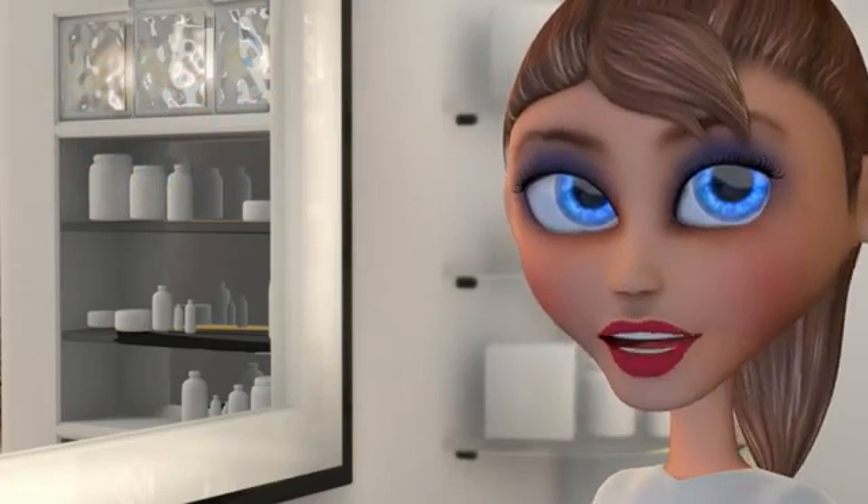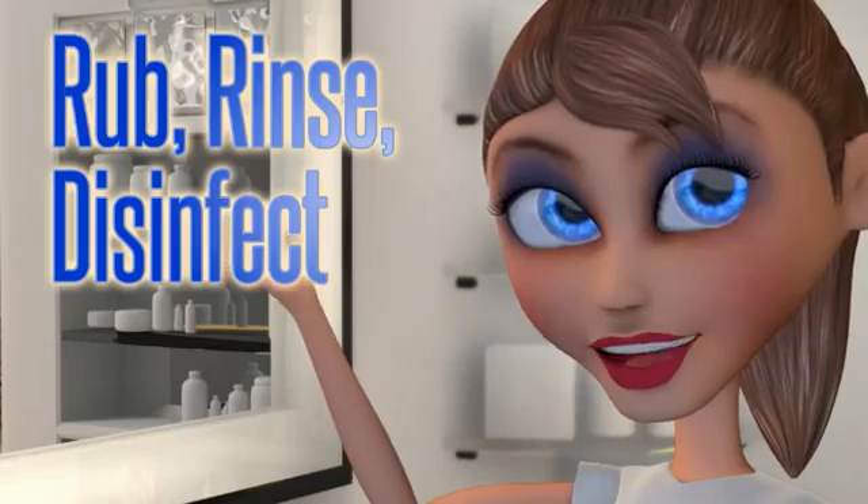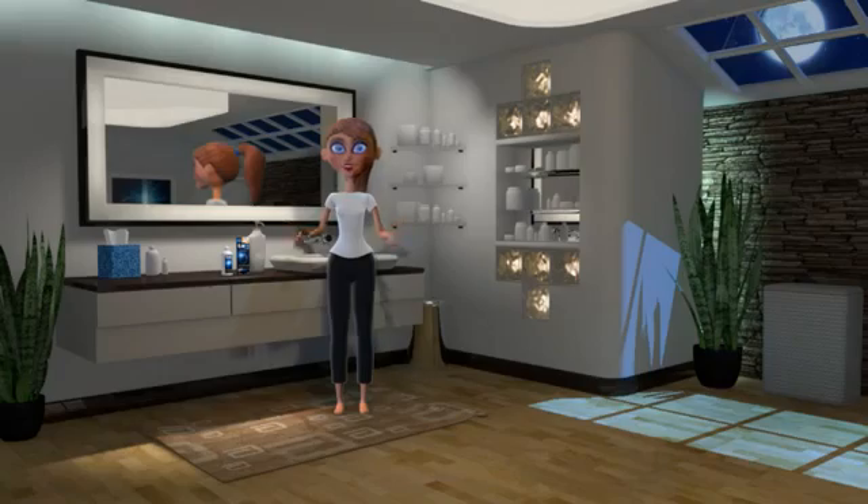Just remember, removing your contact lenses is as easy as rub, rinse, disinfect, and repeat. You now know how to properly clean, apply, and remove your contacts. But before I leave you, here are a few more helpful hints.